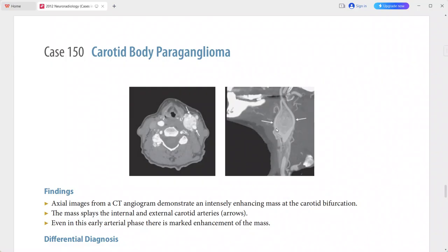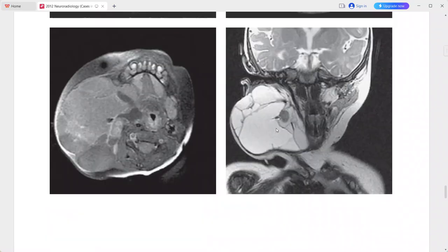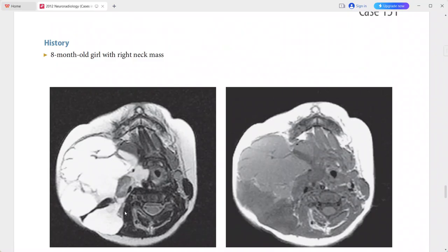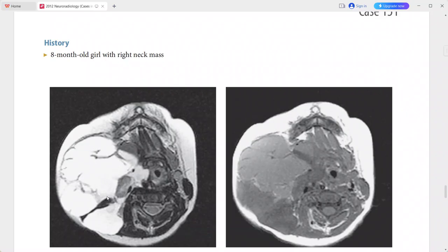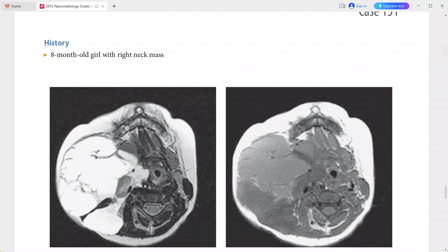Next is an eight-month-old girl presenting with a right neck mass. There is a large multi-septated mass in the right neck. On T1-weighted imaging, the signal intensity is slightly brighter than simple fluid. On T2-weighted MRI, the mass is quite hyperintense.